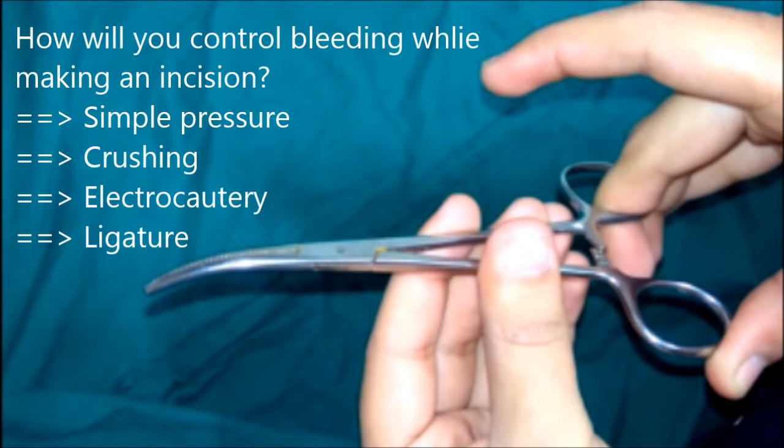To control bleeding while making an incision: fine capillary bleeding may be controlled by simple pressure with a mop. You may use artery forceps to crush the bleeding point — crushing causes curling of the tunica media and intima inwards, resulting in occlusion of the vessel lumen. Alternatively, hold the bleeding point with haemostatic forceps and apply diathermy to cause coagulation, or use a ligature like chromic catgut to control the bleeding.